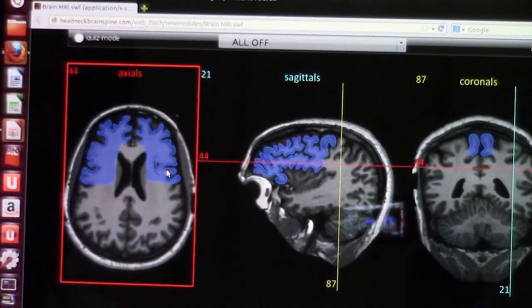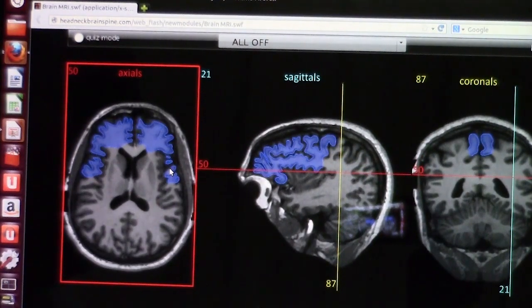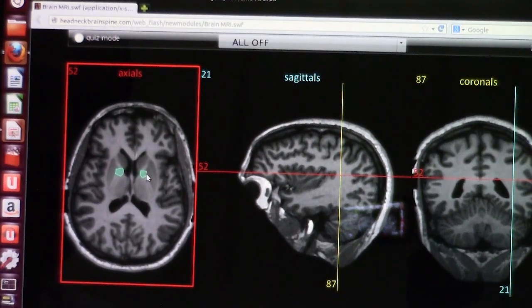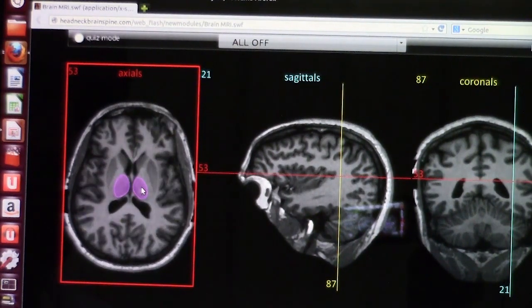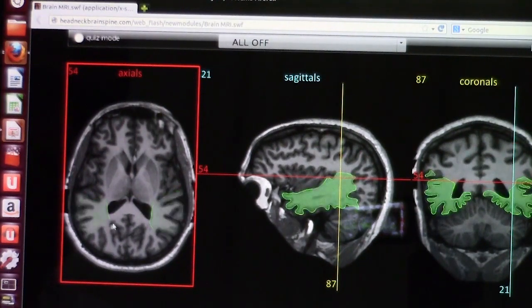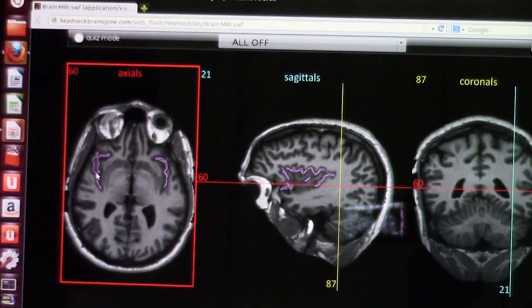Another cut is axial T1 — you can see anatomy best on T1. Here you see the cortex and the parietal lobe, the caudate nucleus, the putamen, the genu of the internal capsule, the anterior limb and posterior limb of the internal capsule. You also see the thalami bilaterally, the atrium or trigone of the lateral ventricle — the peritrigonal area — and the temporal lobe. This area is the sylvian fissure, which can be prominent in certain metabolic or congenital disorders.